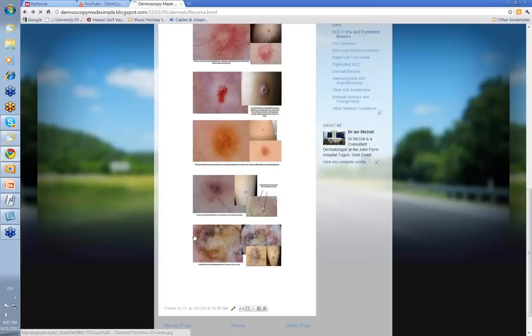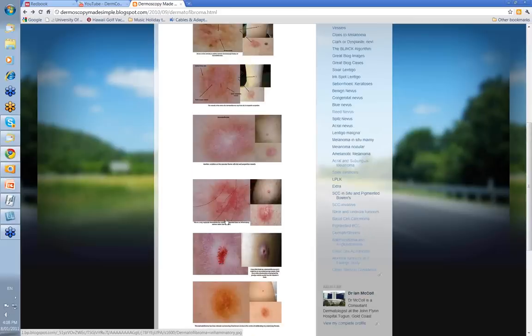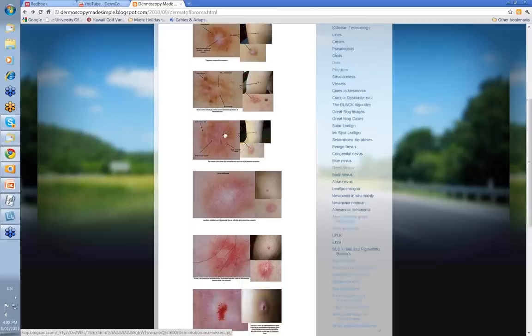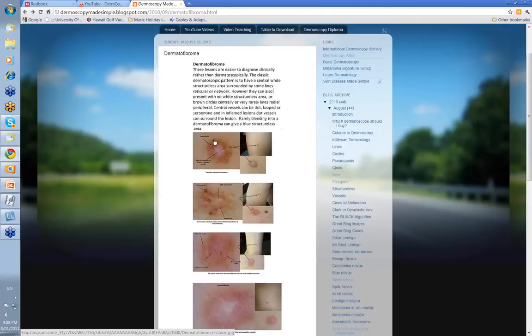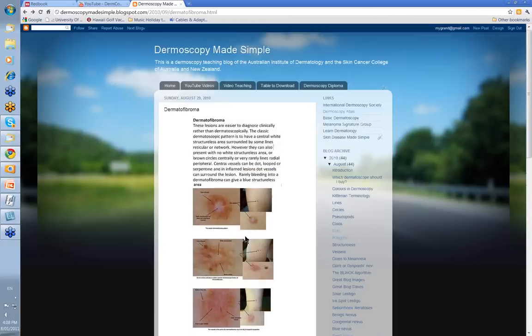So, dermatofibromas — you can diagnose them clinically better than any other particular way, but you appreciate the variation of the dermatoscopic images. The variation in the vessels, whether there is going to be a white structureless area or not. The classic pattern still being the central white scarred structureless area and the surrounding lines reticular — that's what you're going to see most often. Dermatofibromas can be mistaken for amelanotic melanoma if they're very pink, or confused with melanocytic lesions, and as I said they're an inflammatory process. Thank you very much.